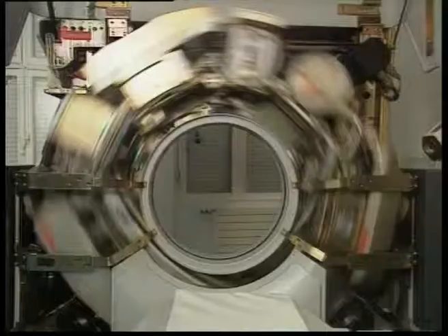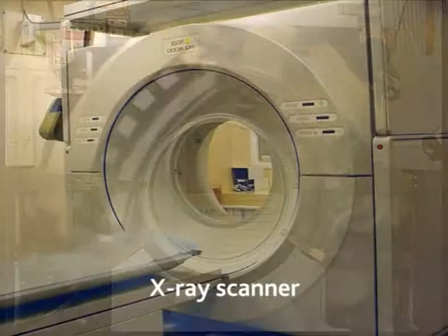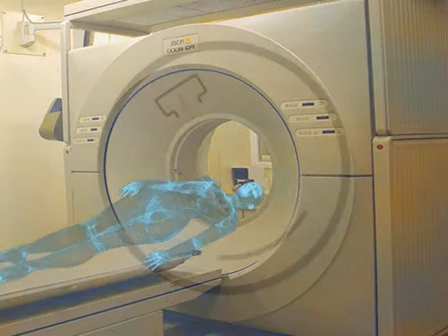The x-ray scanner, invented in the 1970s, overcomes this drawback. It is an x-ray emitter which rotates in a ring. The patient lies on a table which moves inside the ring. The scanner scans the body in successive slices, and the sensors send back data which is converted into high-precision images.